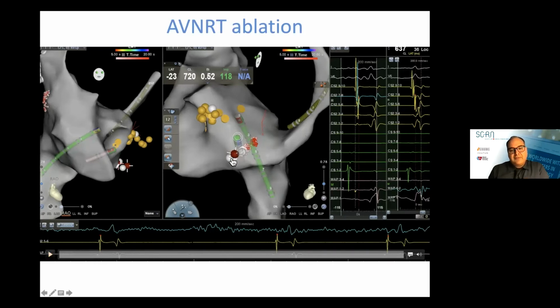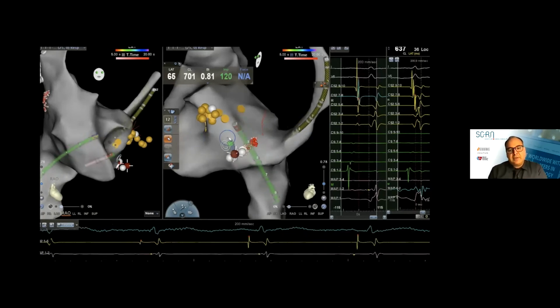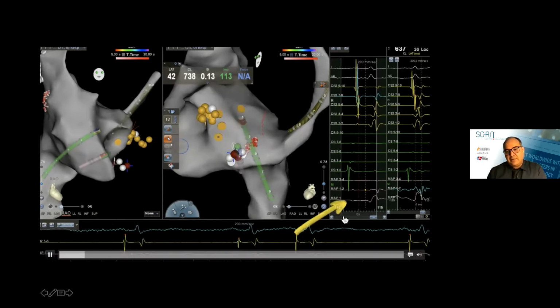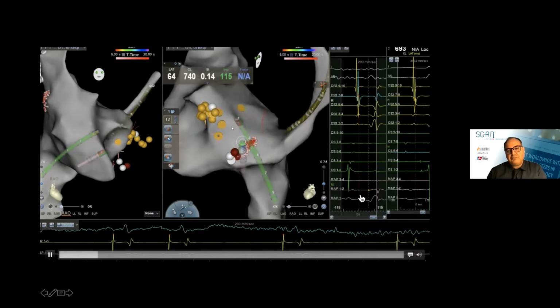We started ablating very low and ventricular down here and no response. Now I have to go more atrial and more cranial, which obviously will get me closer to the His cloud, which we created very nicely here. So I'm going to use the RMT catheter to map that area and do it very diligently. This is not ablation. We're just mapping for the His, and you can look here. This is a mapping catheter. There's no His there.